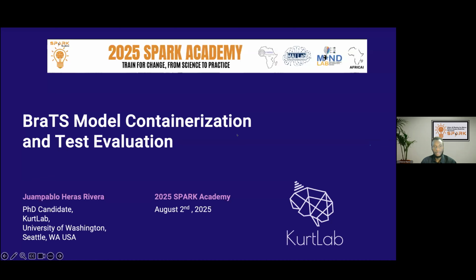All right, hi everyone. You're all welcome to this tutorial, and this tutorial is very important to your participation in the BraTS challenge because the next phase of the challenge will require every team that has submitted a short paper to be able to submit their containerized model for the test evaluation.